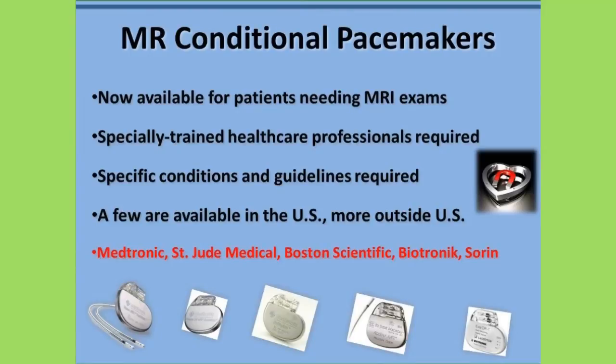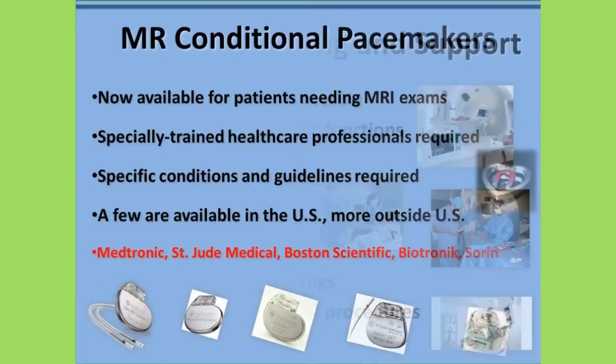So now you've seen several examples of MRI information for a variety of implants. Keep in mind that information exists for thousands of different biomedical implants and devices as well as for patient support equipment that has undergone testing for MRI issues. The MRI labeling information may be found at the respective manufacturer's website, or you can visit MRIsafety.com.